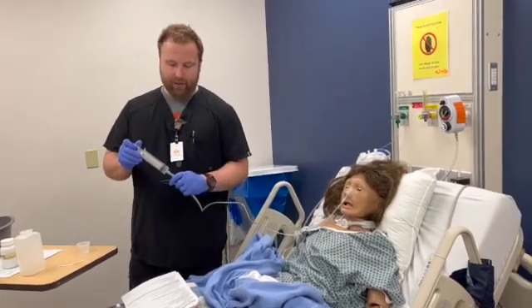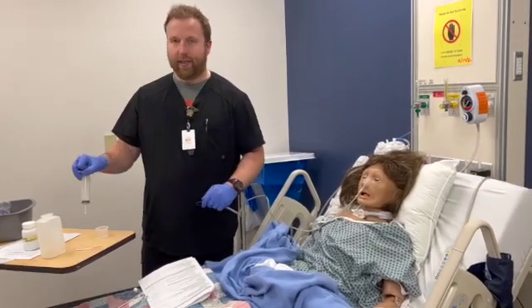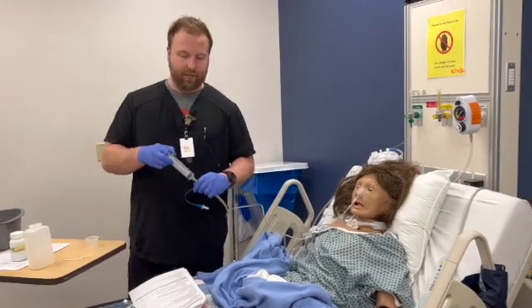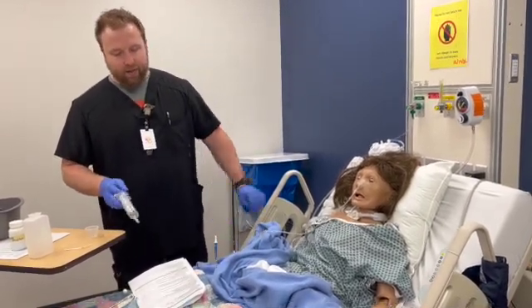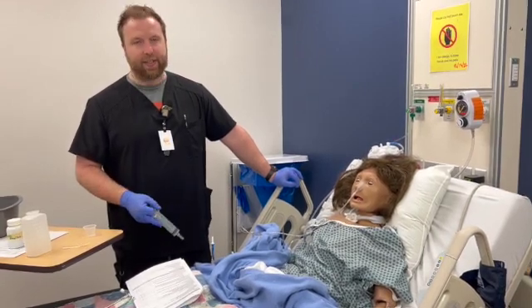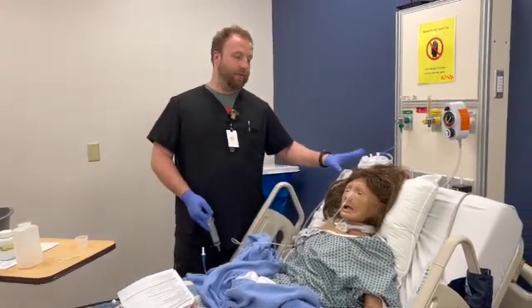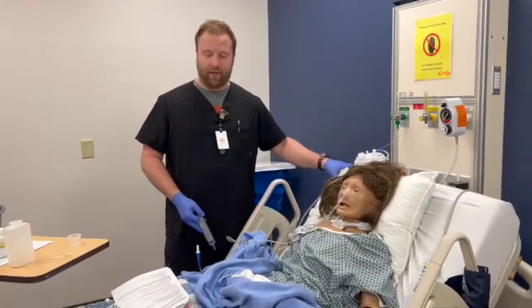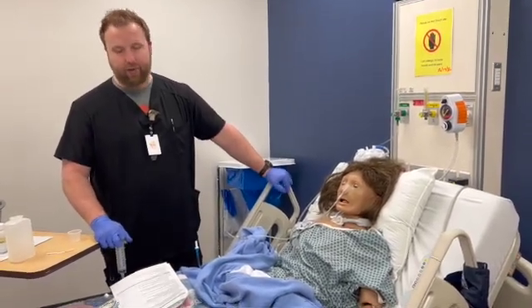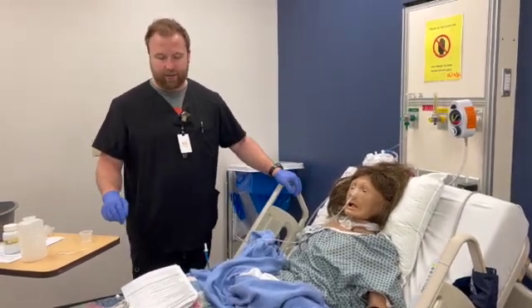And again, we would crush 1 pill. So if we had 2 Tylenol, we'd crush 1, give it. I would flush with 5. I would crush the second Tylenol tablet, mix with water, give, and then flush with my last 5 ml. I would continue this till all my medications are given. I would assess how the patient is tolerating this too. Make sure that after we're done with the medication, I'm going to keep the head elevated for at least an hour, especially if there's no tube feeding. And then I want to document my intake and how the patient tolerated.